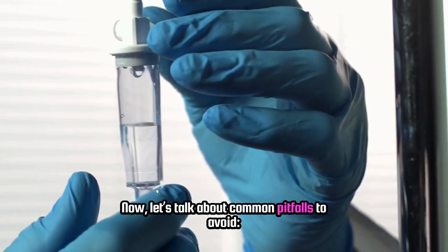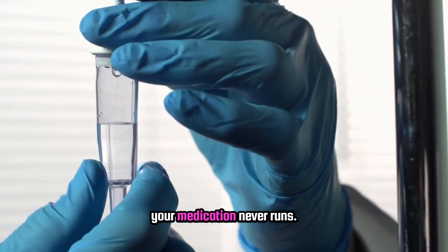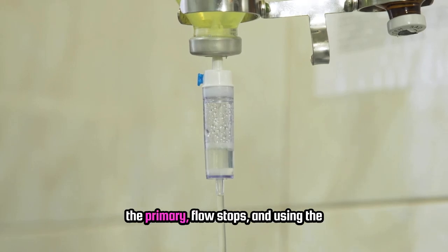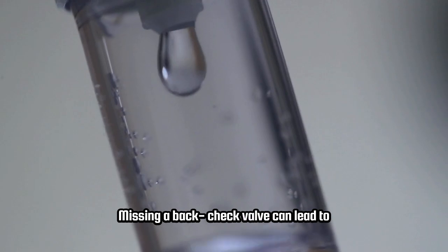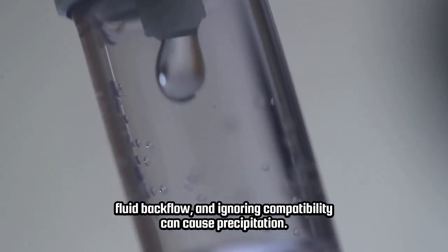Now let's talk about common pitfalls to avoid. A closed secondary clamp means your medication never runs. If the secondary is hung lower than the primary, flow stops, and using the wrong Y-site can disrupt sequencing. Missing a back-check valve can lead to fluid backflow, and ignoring compatibility can cause precipitation. Skipping disinfection raises infection risk, so pay attention to these details.